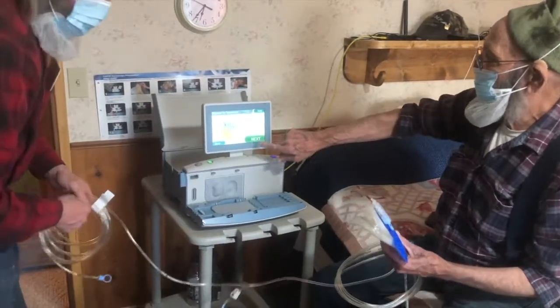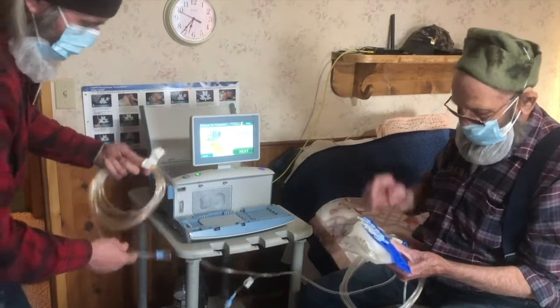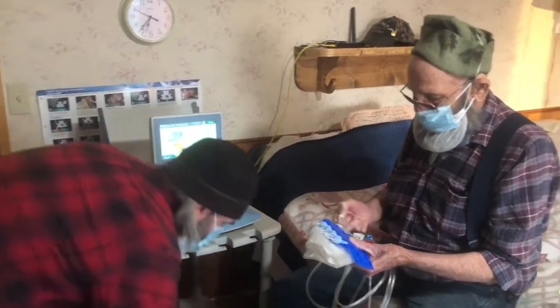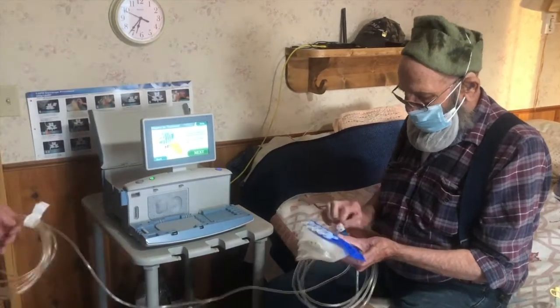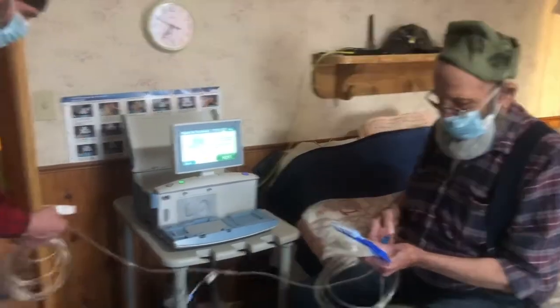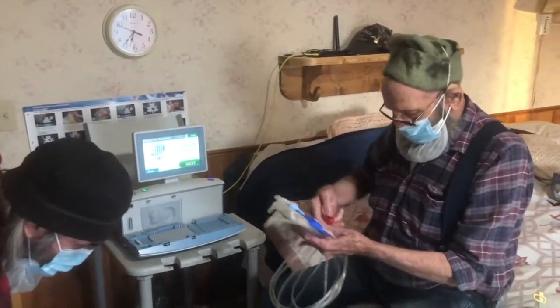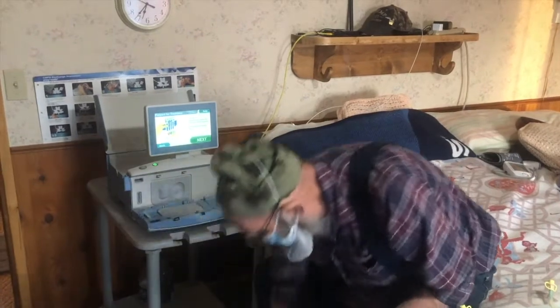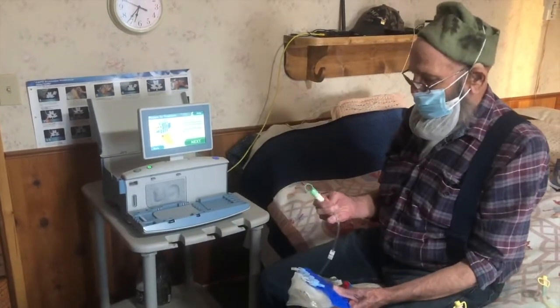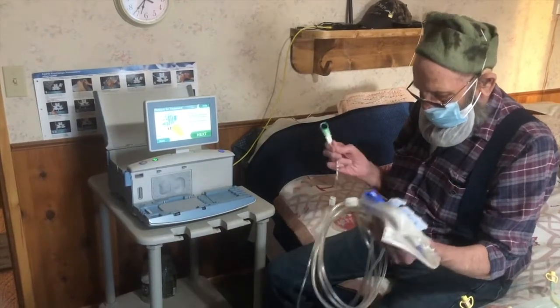So the next thing it tells you to do is to close off the 4 solution line clamps in the line organizer. Do not clamp the patient line. You close 4 of these here, but you don't clamp the patient line, and see, my patient line just fell on the floor here. That's what I was looking at. But it's still got the cap on it. So anyway.